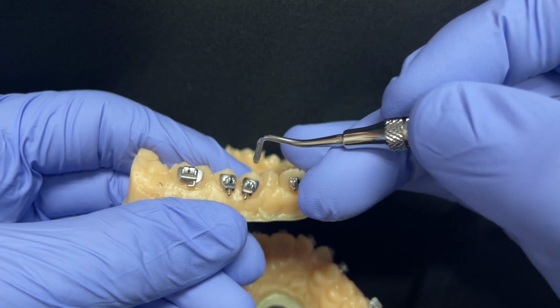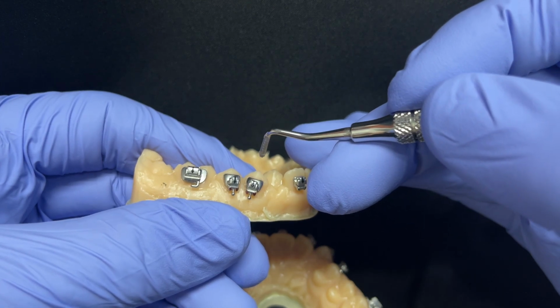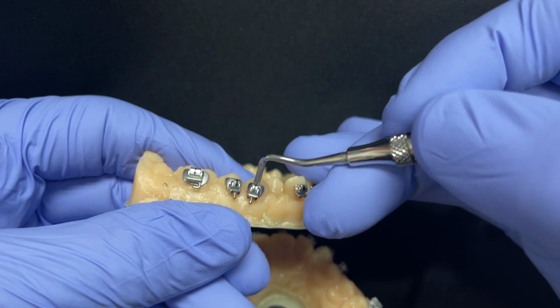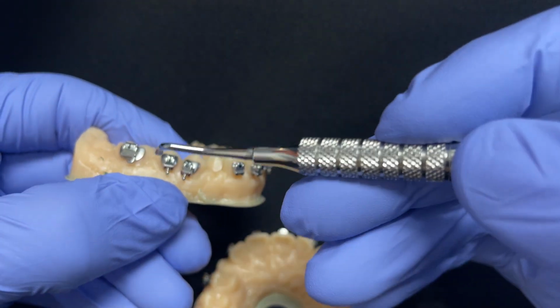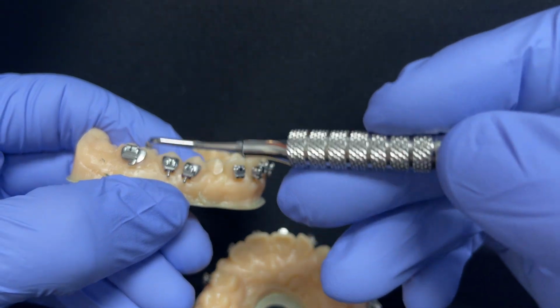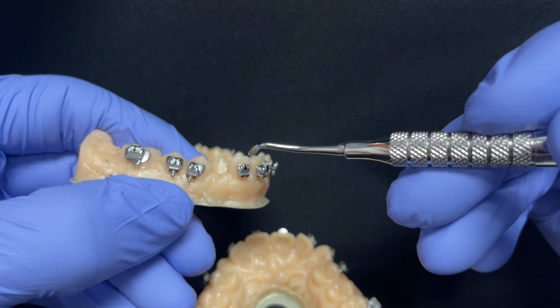Whatever you have on the 5, you want slightly more, maybe half a millimeter more on the 4. And if you can get another quarter millimeter squeezed out, then hallelujah, because that is going to help you create this curve of Spee within your bracket placement, which then is going to cause your wire to act almost like a reverse curve of Spee.